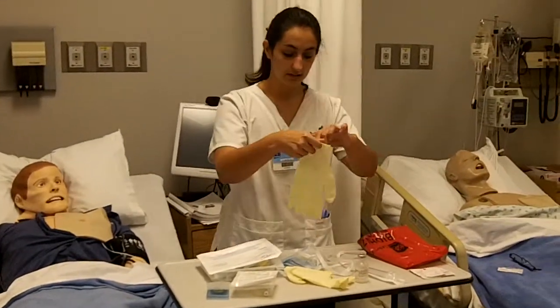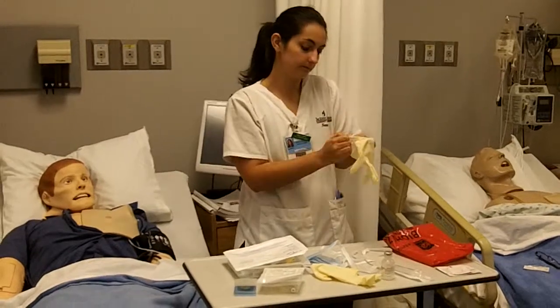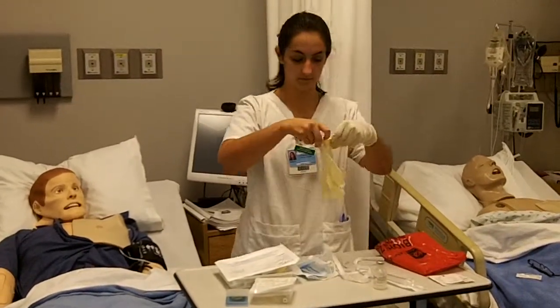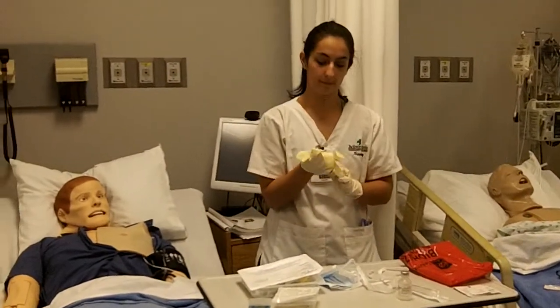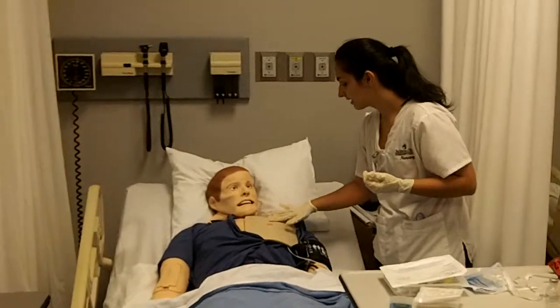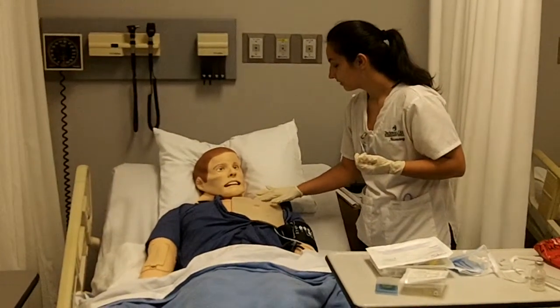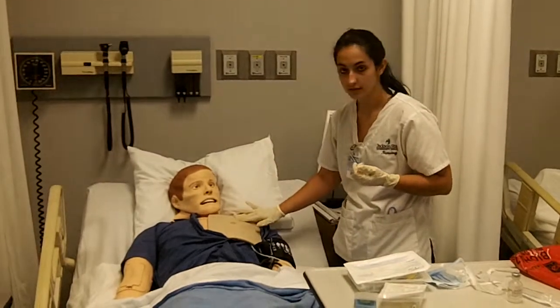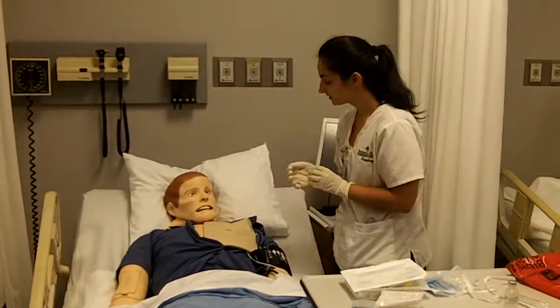I would don clean gloves. And I would palpate his life port access, and I would make sure that there is no edema, swelling, tenderness, or pain. Everything's good.